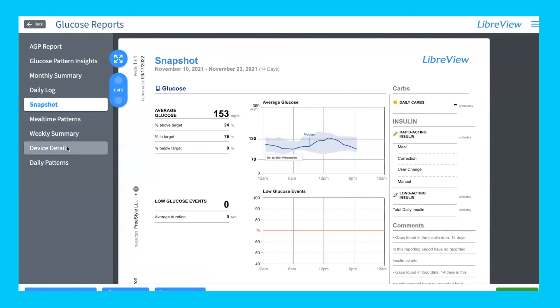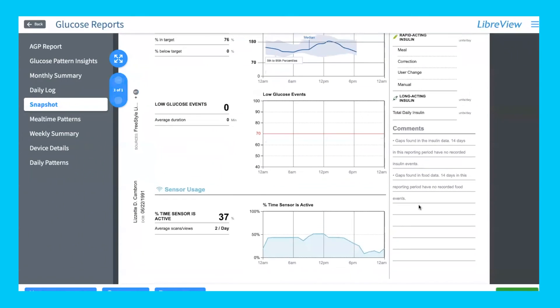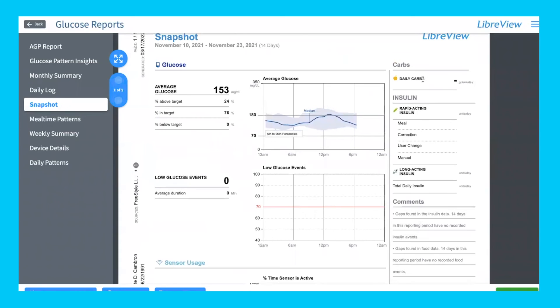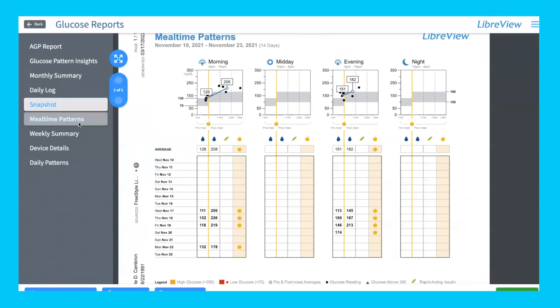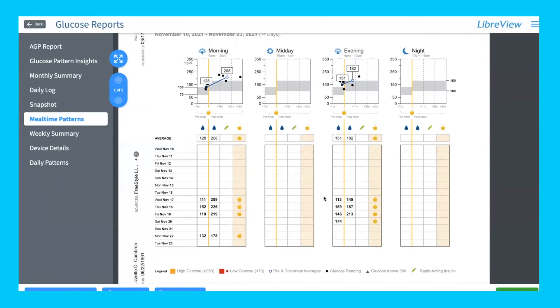There are other options here as well. Snapshot is a quick overview similar to the homepage. There's also a notes section showing carb entries and insulin logs — any information entered in your monitor or mobile app appears here. Mealtime patterns is a particularly useful page because it breaks your data down by mealtime, helping you see what you're eating and how your blood sugar responds. This is a great page to discuss with your healthcare provider, or to consider seeing a nutritionist.